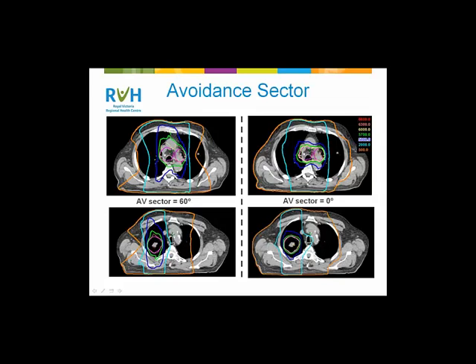Were any comparisons done with compensator-based IMRT for motion interplay? Good question. No, there were none. You'd have to go to the paper to be sure, but I'm pretty sure there was not any compensator-based delivery in there. That's an interesting question because a lot of the interplay that we see here is because of the dynamic component of the MLC-based delivery. You don't have that with compensator-based delivery, right? Even though you've got a fluence, that fluence is, in effect, static. Once you turn the beam on, if you were to look in a plane underneath the compensator, the dose is what it is while the beam is on, as opposed to the MLC delivery where it's sweeping across the field. So the interplay would definitely be less for the compensator-based IMRT. There was a whole bunch of curves in that paper that I didn't talk about, so if you check that reference, it'd be interesting to see.